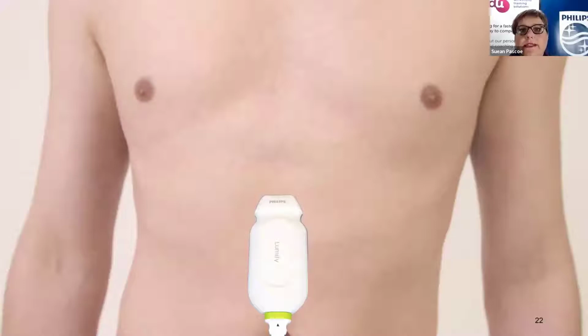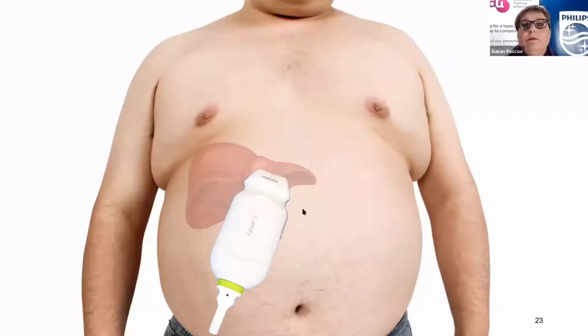The next tip I'd say, for most of your thinner patients, you'd pop your probe on in the midline here. And for most patients, you point the probe to the chin. The heart is left-sided, but the normal heart spends a lot of time right in the middle. Sometimes you just need to point slightly to the left side of the chin. But in your larger patients, what you might need to do is move your probe a little bit to their right so that you put more liver between you and the heart, and you take advantage of the liver as a window.